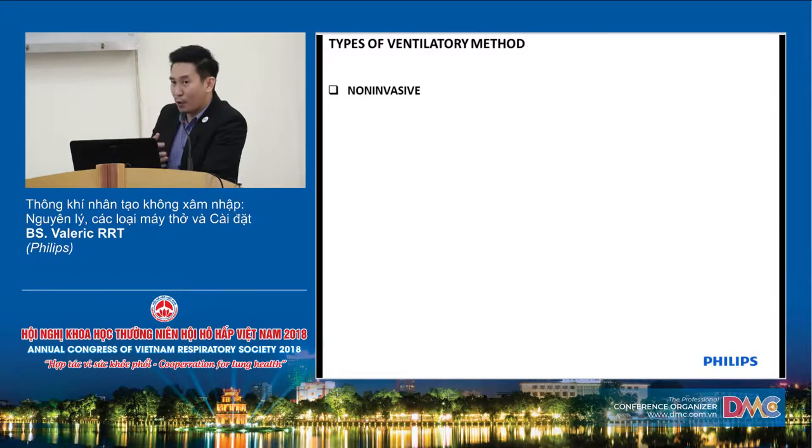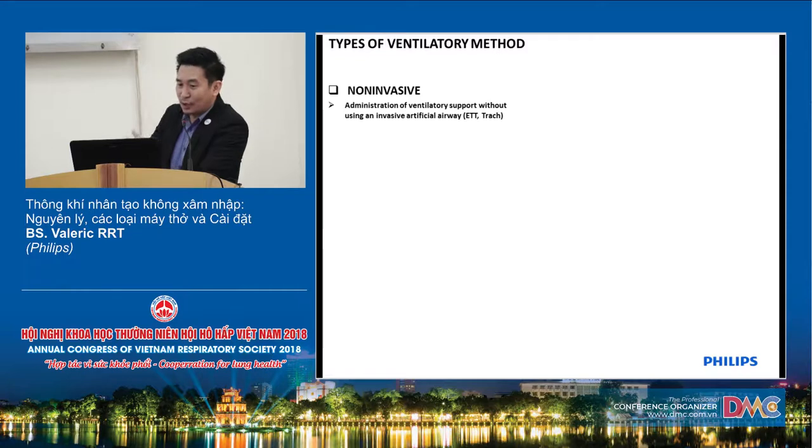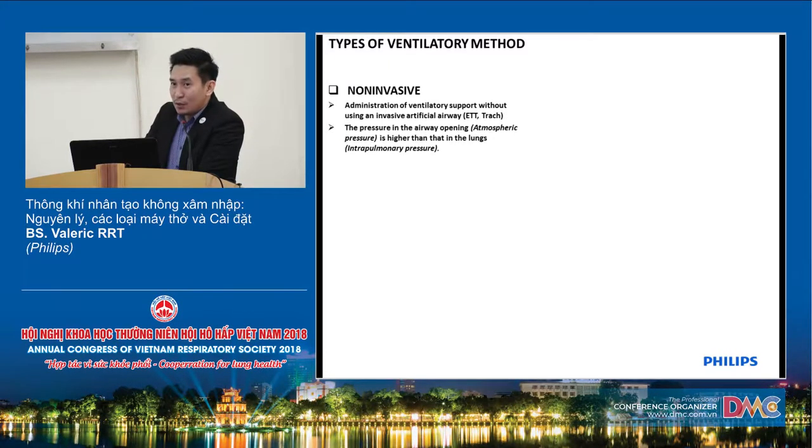one of the, before joining Philips, one of the popular brands in terms of non-invasive ventilation is Respironics. They invented in 1985 the first positive pressure ventilation to treat obstructive sleep apnea. So they call that sleep devices. So non-invasive ventilation is basically ventilation support without using an invasive endotracheal tube or tracheostomy. So we're dealing with pressure, so we need to exert a higher pressure, above atmospheric pressure, to open up the lungs. And it provides different interfaces, nose, mouth, or face, for you to be able to deliver the positive pressure to the patient.